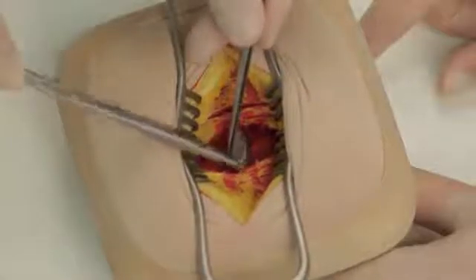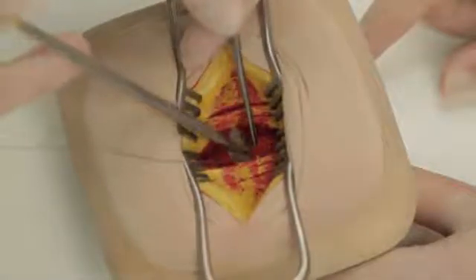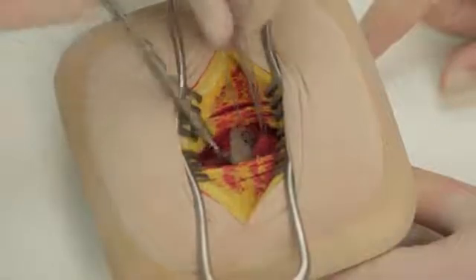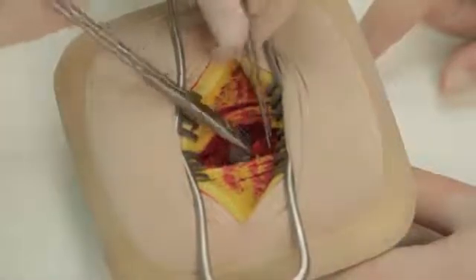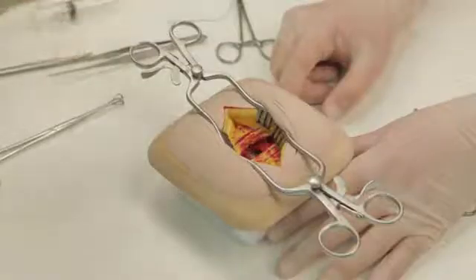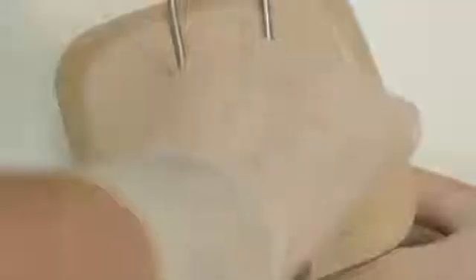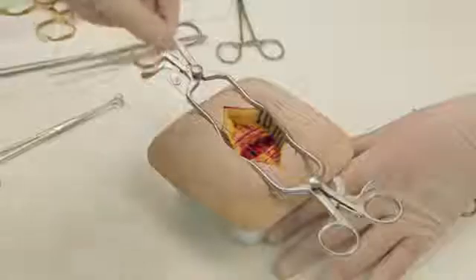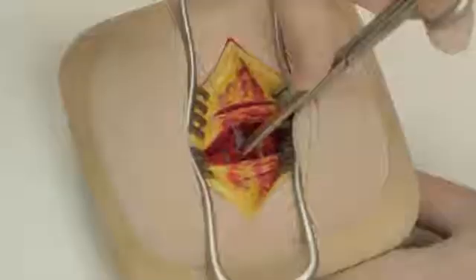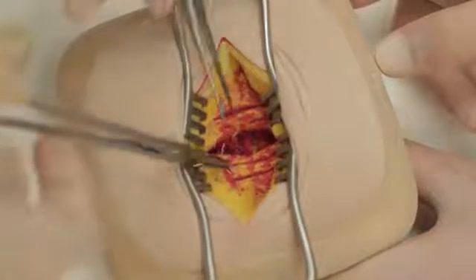Loose, interrupted 2-O Vicryl stitches should be used to oppose the muscles of transversus abdominis and internal oblique. External oblique is closed using a continuous stitch of 2-O Vicryl.